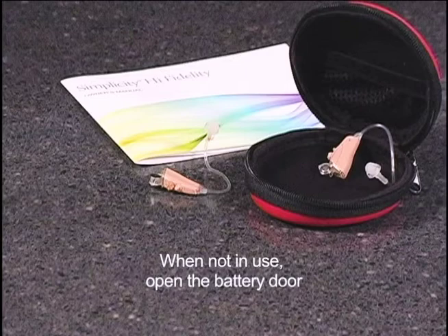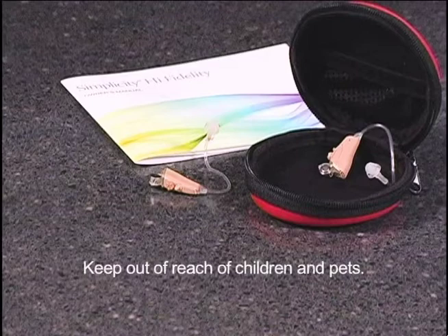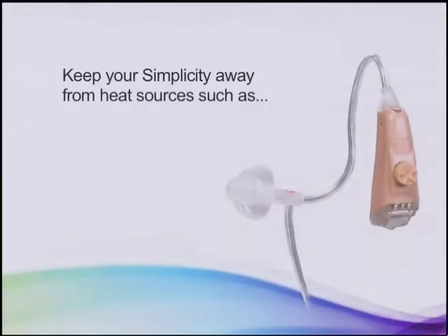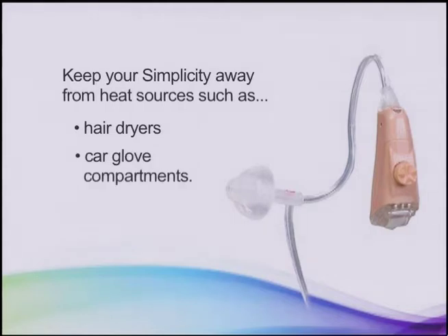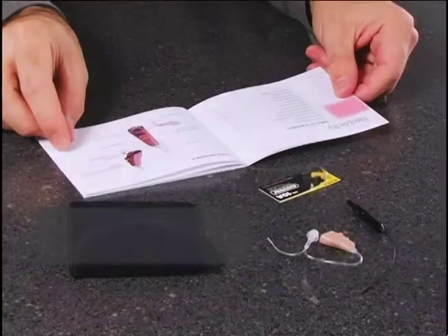When not in use, we recommend that you open the battery door and store your device in the soft travel pouch. Be sure to keep Simplicity out of the reach of children and animals. Keep your Simplicity away from heat sources such as hair dryers or car glove compartments. Do not wear while showering or swimming, and avoid getting hairspray on it.